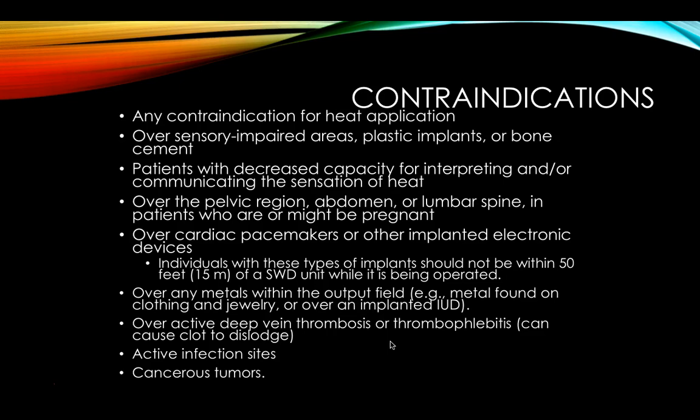Over growth plates, there's some debate, just like there was with ultrasound, of not doing it over open growth plates. Same with over the testes or the eyes or areas with a lot of joint effusion. Protruded nucleus pulposus, so someone who has a herniated disc, ideally potentially not doing diathermy over that either.